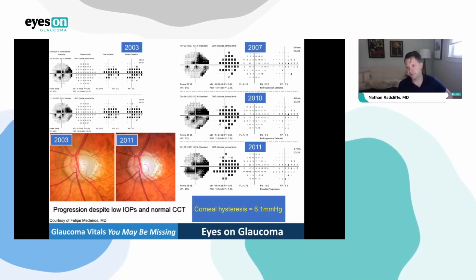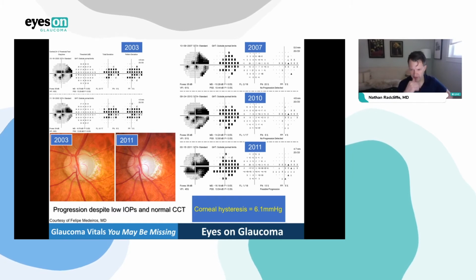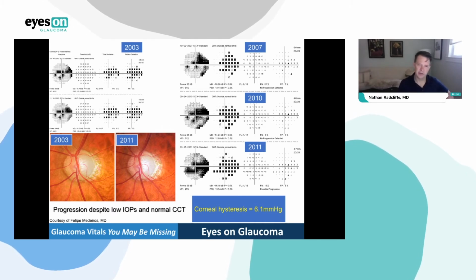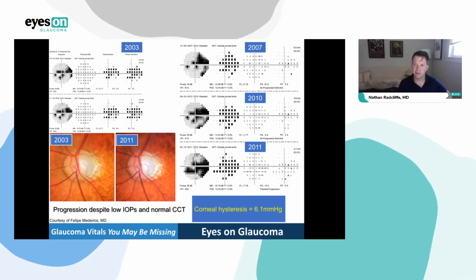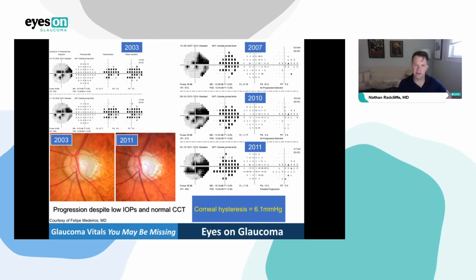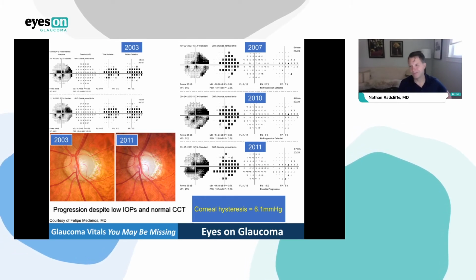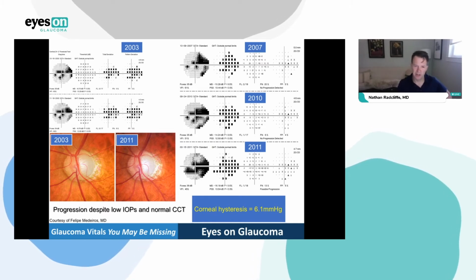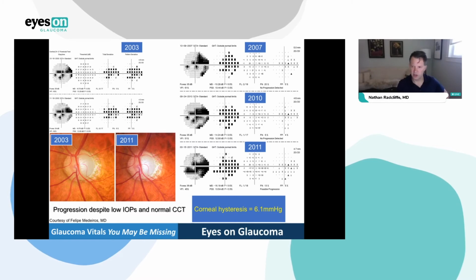And hysteresis is measured, and it is found to be 6.1. That's very low. Just to, again, you're hearing some of these numbers for the first time. 10 is certainly normal. 9 to me is borderline. 8 is low. I hear often 9 being low, and in a technical sense, it's a little low. But is 19 a high pressure? It's still within normal range. So these are just general guidelines.